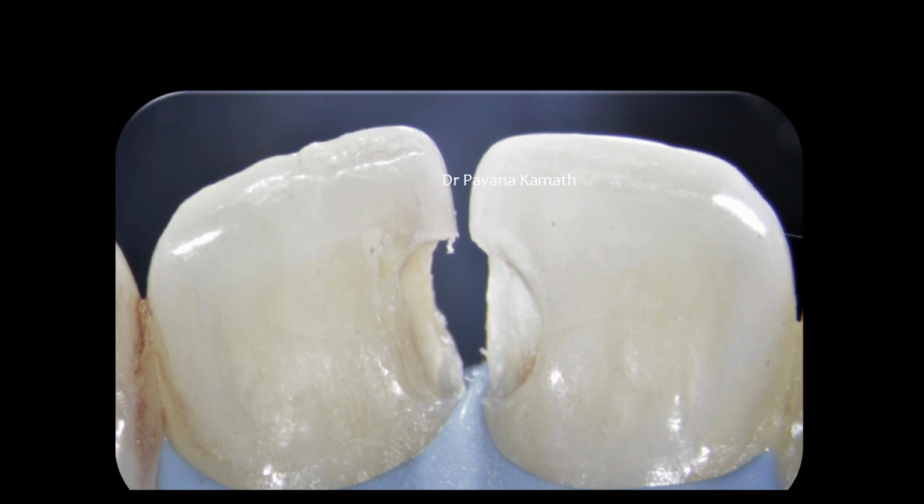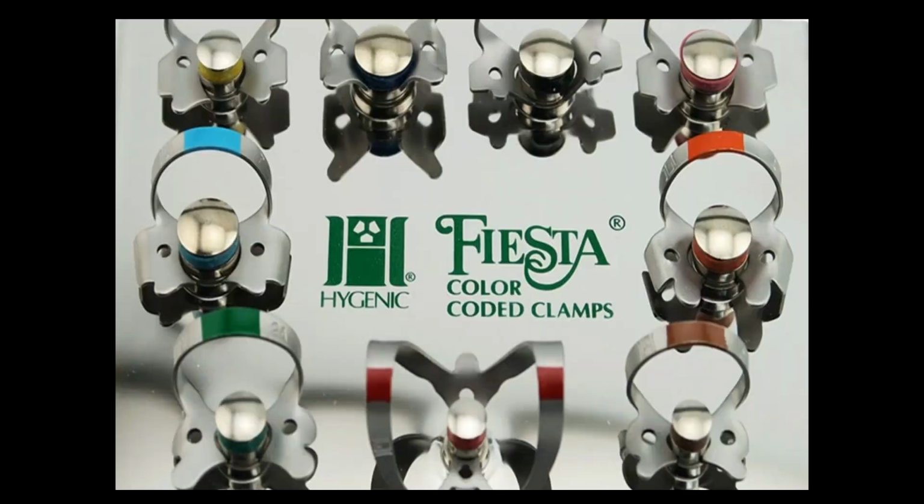Now this is what we need. We need a good retraction of the soft tissues, moisture control, and good access to the site of work. And this is what we have to target when you're performing your rubber dam isolation. Now coming to the clamps. See, this is what we get in our Coltene clamp kit. It's a complete, near complete kit. You have almost everything. This is the kit which has the clamps for adult teeth, and if you observe them closely, you have winged and wingless.